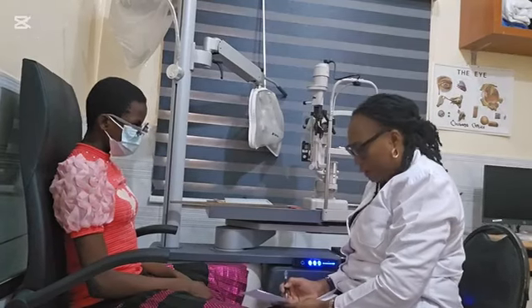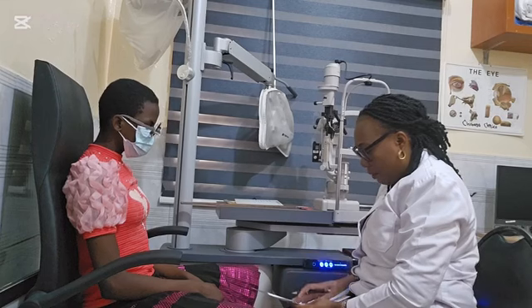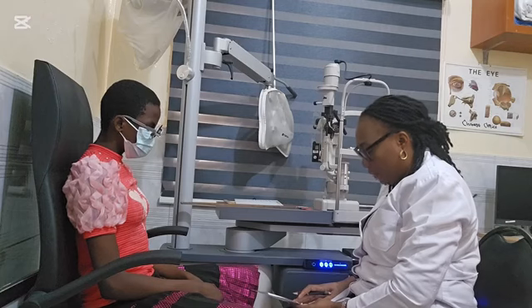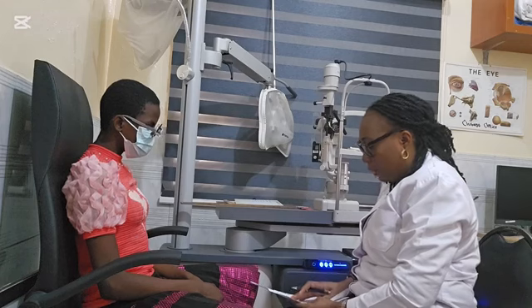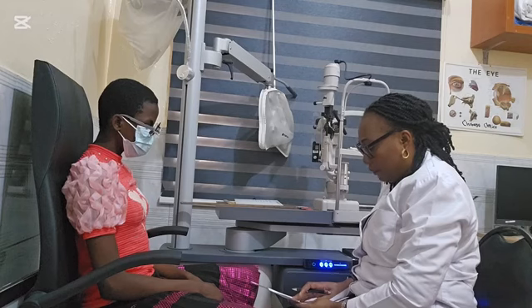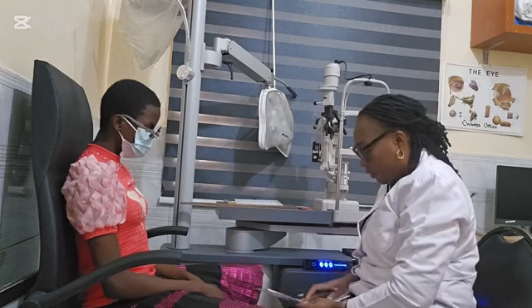So after the retinoscopy, the right eye shows high myopia and some degree of astigmatism, same with the left side. It is -8 sphere combined with -1.75 cylinder at 10 degrees for the right eye, and then -9 combined with -2.50 cylinder at 170 degrees.